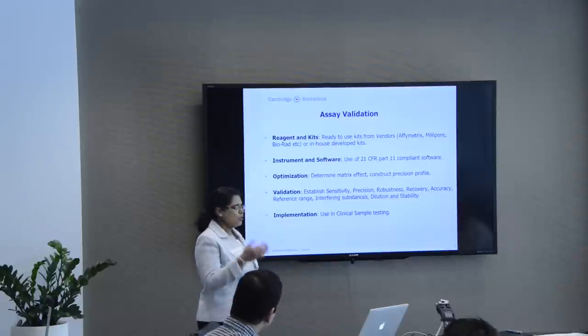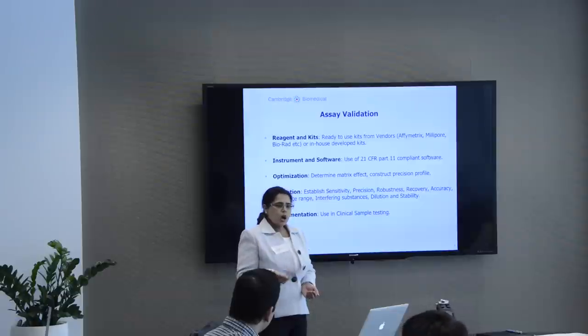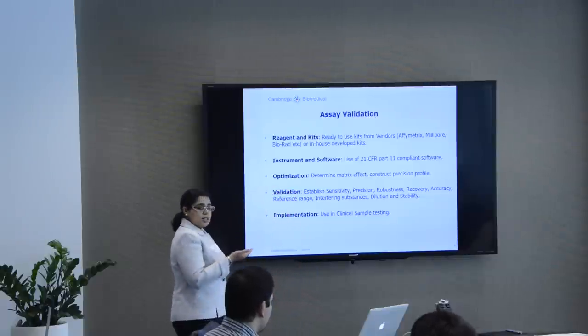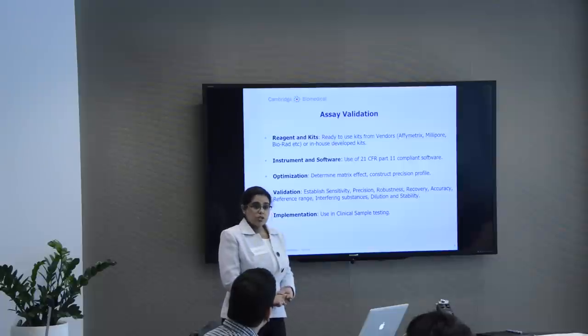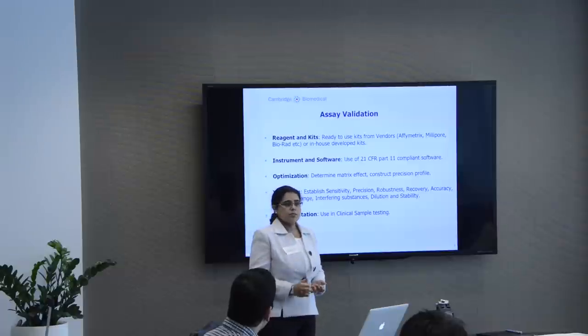Then optimization. Even if you get ready-to-use kits, you still need to optimize the assay. You still need to know what the components are and what tweaks you need to make before you begin your validation. Then validation begins, and this is what we test. We test sensitivity, precision, robustness, recovery, and accuracy. We develop reference ranges for the controls. There's drug interference that you need to test, dilution studies that need to be done, and you test for the stability of the samples.